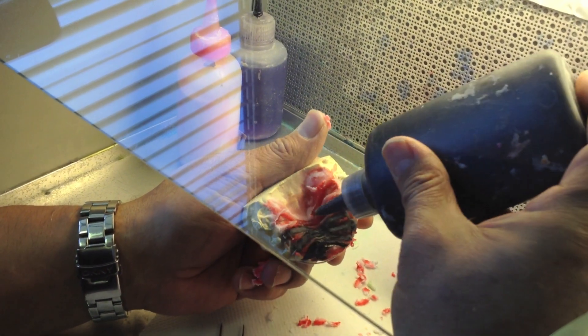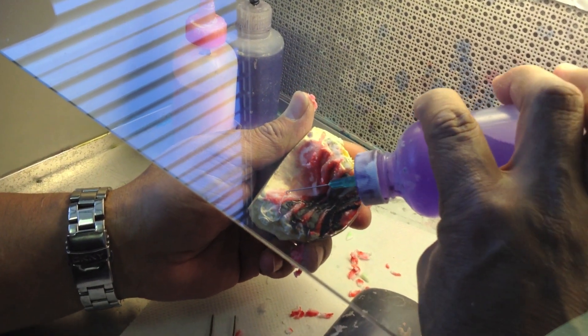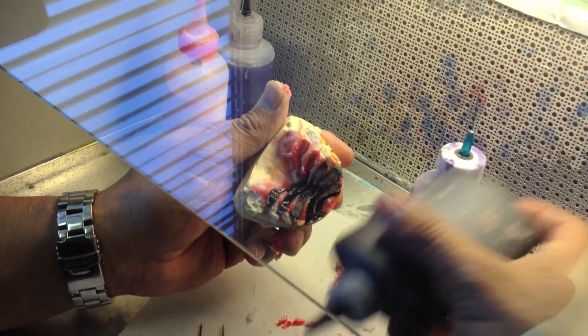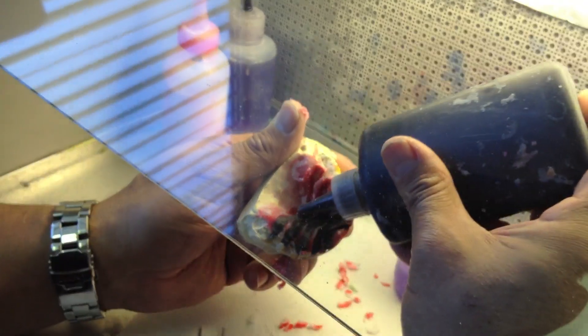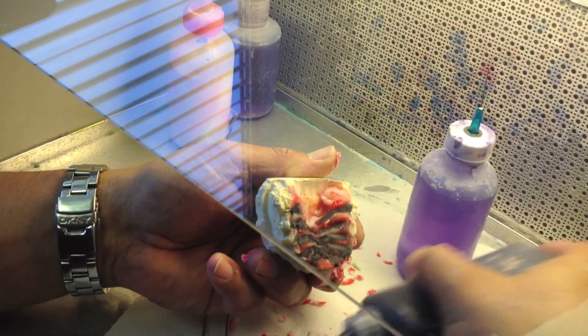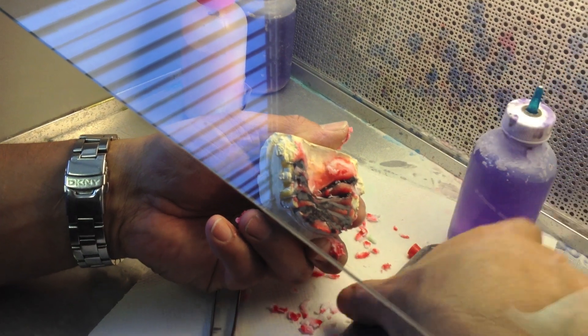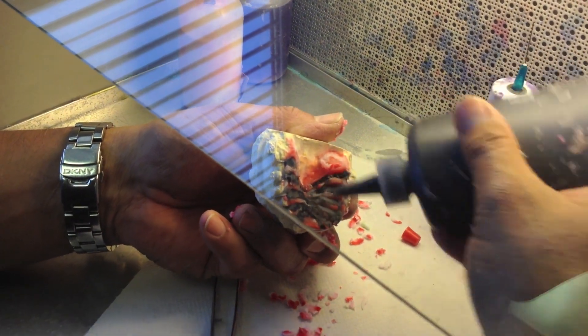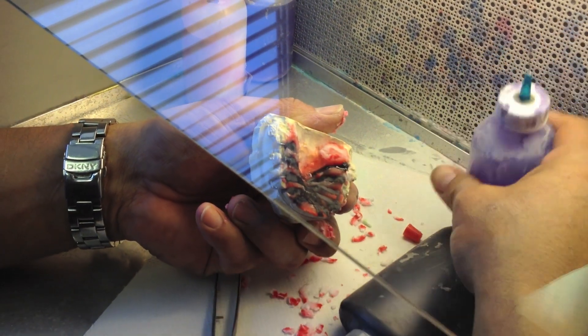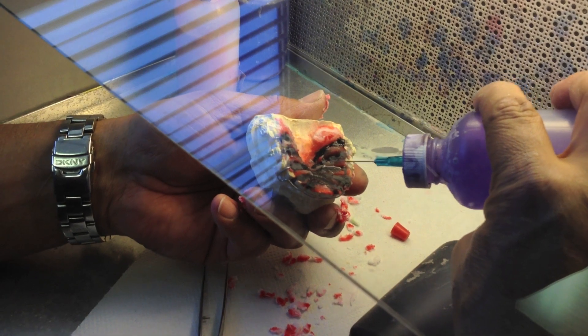Ivan is trying to keep the colors separate even though you're going to be grinding this top layer off — he's keeping the pattern uniform. When he thinks he's got enough black in the trenches, he's going to fill in any shallow spots with clear monomer to give it a clear coat. He'll grind away the clear stuff he doesn't need, and the stuff he does need will stay clear and reflect the pattern through it.